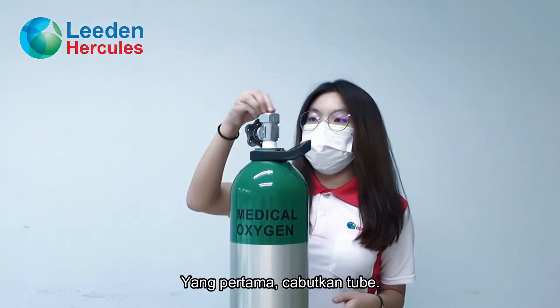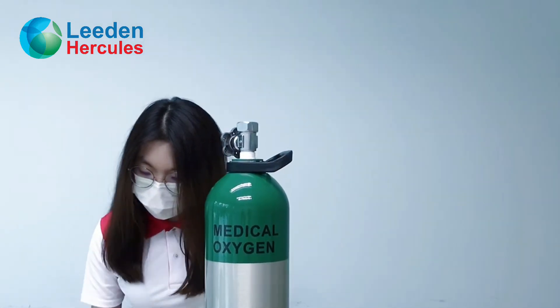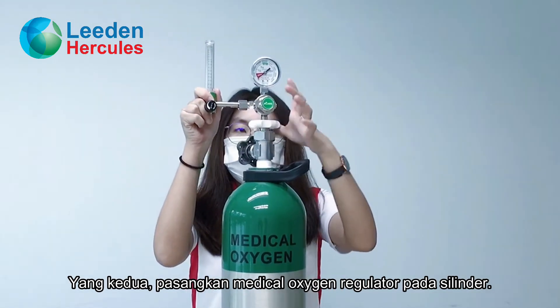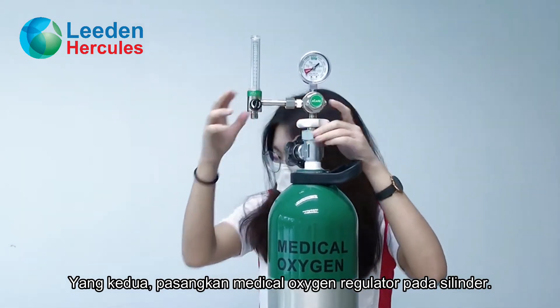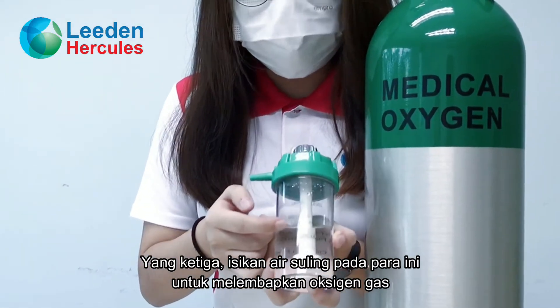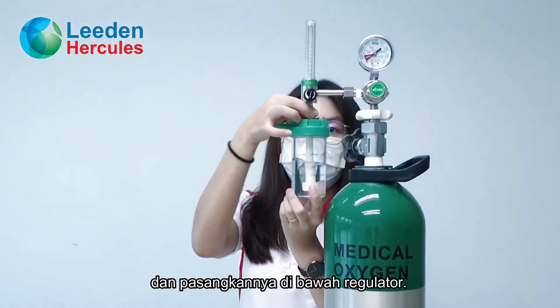First of all, let us take out the tube. Then, install the regulator on the cylinder. Then, fill the distilled water to this level to moisturize the oxygen gas. Then, fix it under the regulator.